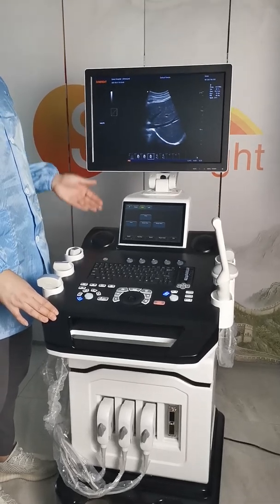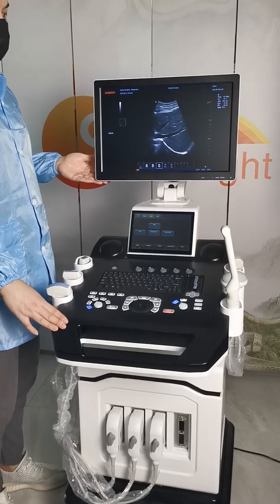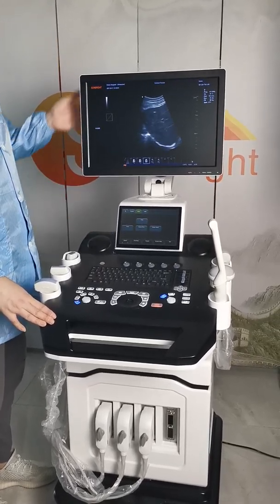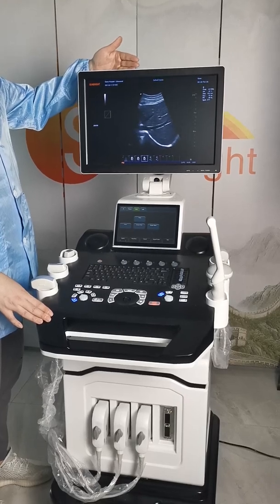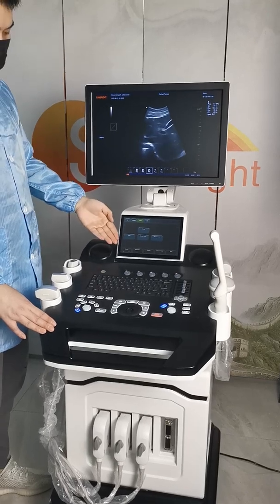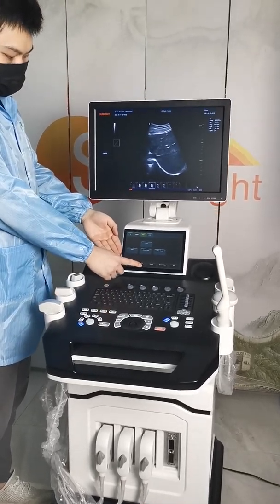This is our Trolley Color Doppler Ultrasound 908 series. It has two screens. The bigger one is 19 inches, which is used to show the images. The smaller one is the control panel. It is touch screen, very convenient to operate.